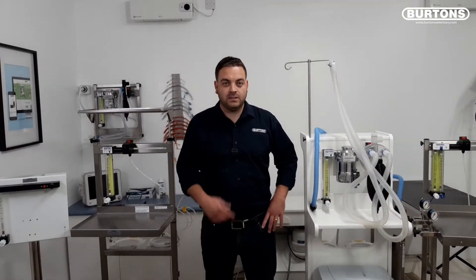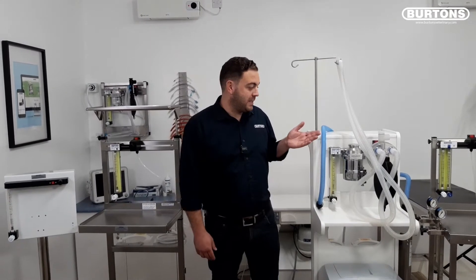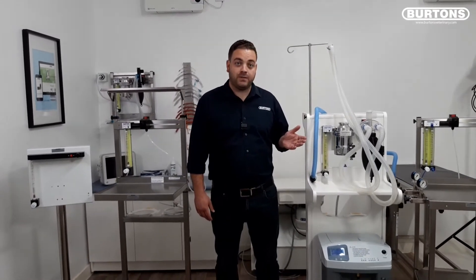Hi everyone, Dan from Burtons here. In this video I'm going to talk you through the Burtons anaesthetic machines. We'll talk about their standard features and some of the accessories available.